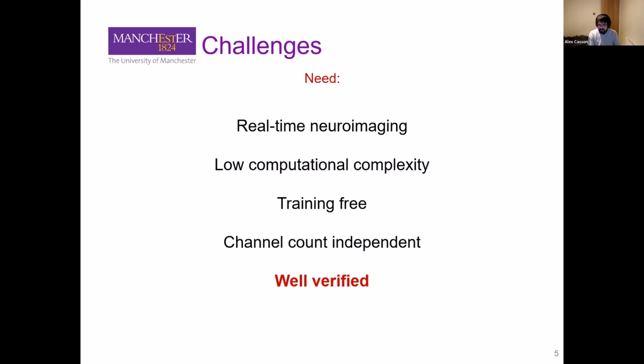We're also very keen, not necessarily essential, but very keen, to be channel count independent, because we've got our eye on doing this out of a lab potentially in X many years' time. We don't want to have to set up 256 electrodes. We want to be able to do it with a minimal montage that can be done fairly quickly, and all of that sort of stuff.